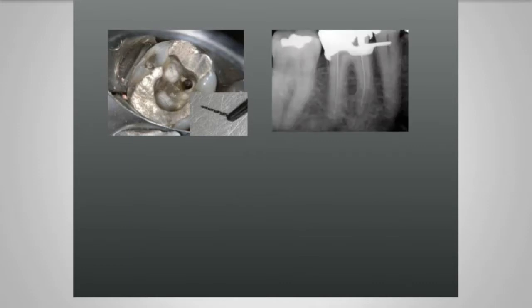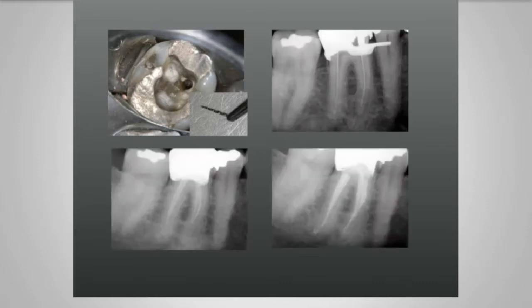We've got our working length estimation radiograph there. This is the pre-op, again with the broken instrument in the mesial canal, and that's been retrieved and the case has been completed. And you can see where the Gates-Glidden burr has done its work there. There's a tiny little step, but it's a conservative approach, and it hasn't damaged the root canal or risked perforating it.